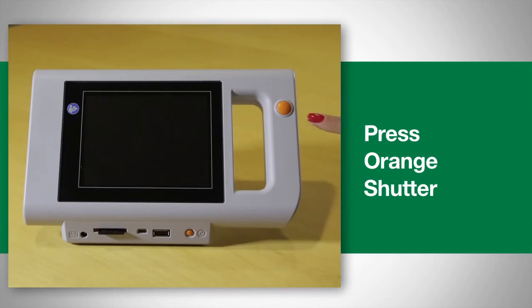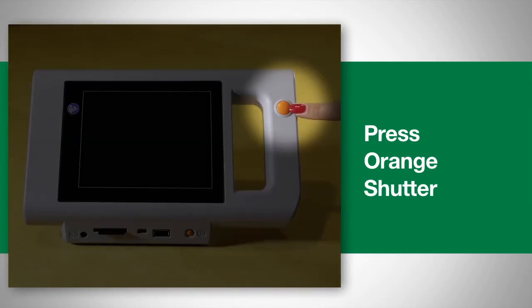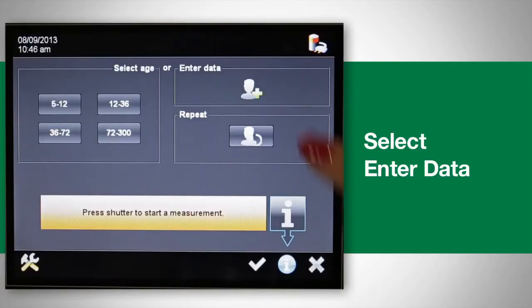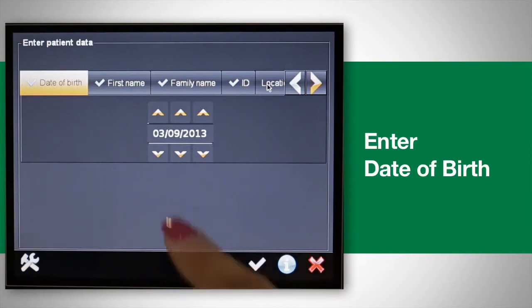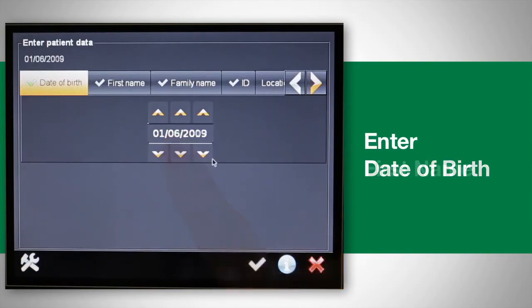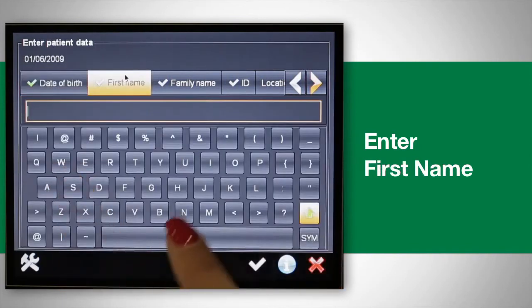You can now begin the screening by pressing the orange shutter button. If a child's name is not in the database, you will have to enter it first. Select "Enter Data," enter the child's date of birth, then enter the first name followed by the last name.